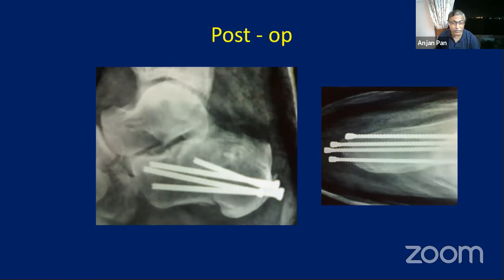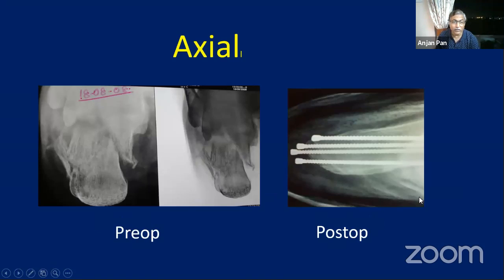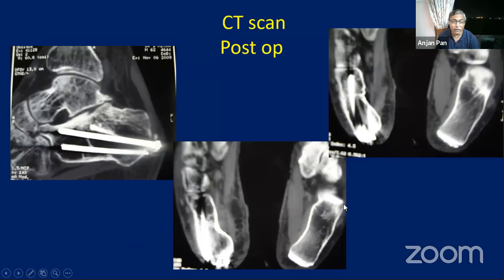This is the post-op picture. This is the pre-op and post-op lateral view. And this is the axial pre-op and post-op. So, CT scan post-op.